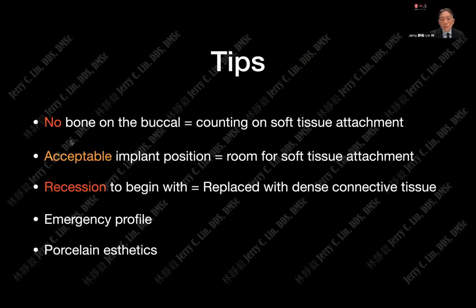So tips for this case, even though we have no bone on the buccal, we can count on the soft tissue attachment to cover the exposed threads. And the key is acceptable implant position, so we have some room for soft tissue attachment.